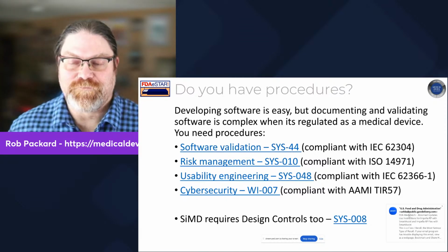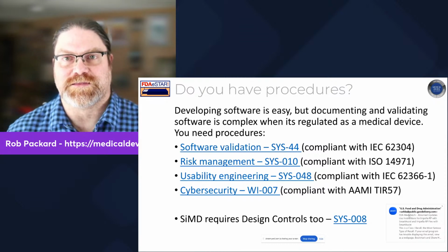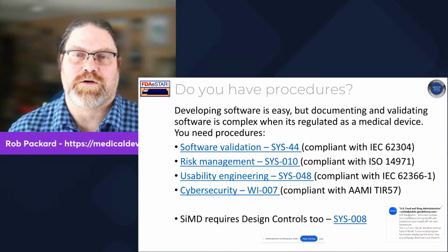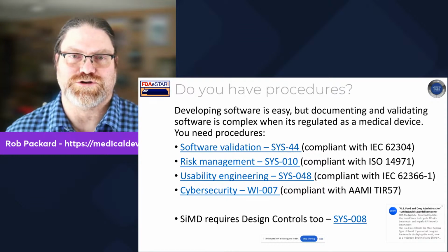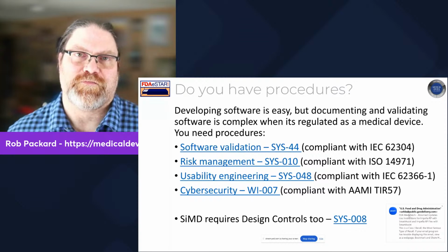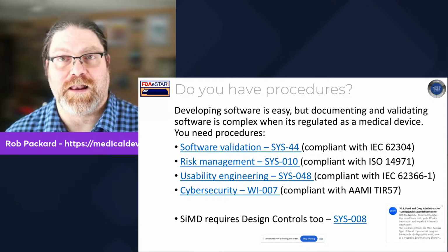And if you're going to do software in a medical device, so this has some hardware that touches patients in addition to the firmware and software that's part of the device, then you need a traditional design control procedure in addition to those four procedures. But if you're just doing software as a medical device, do yourself a favor and get those four procedures in place and follow them.